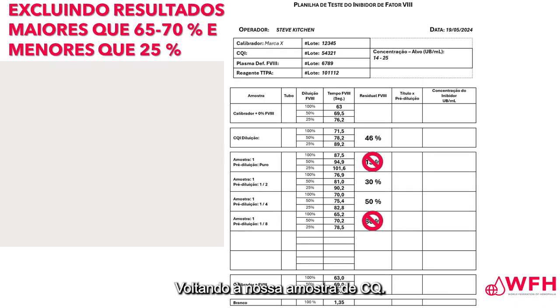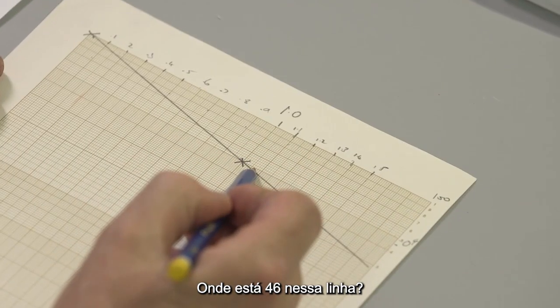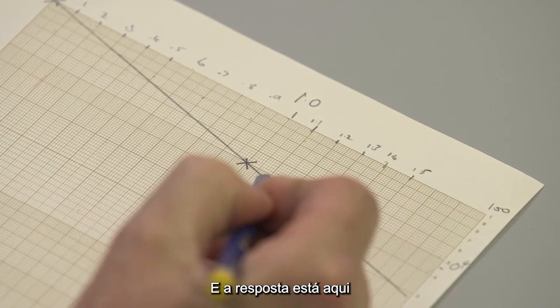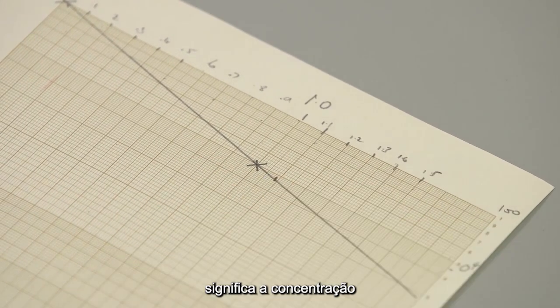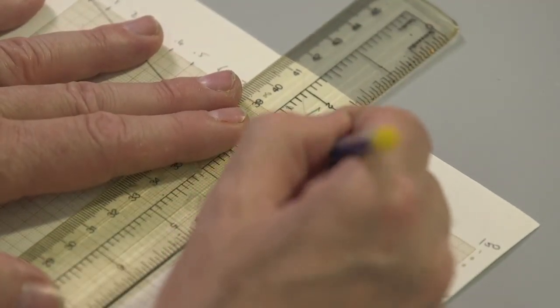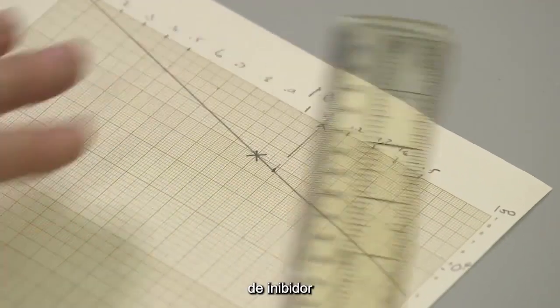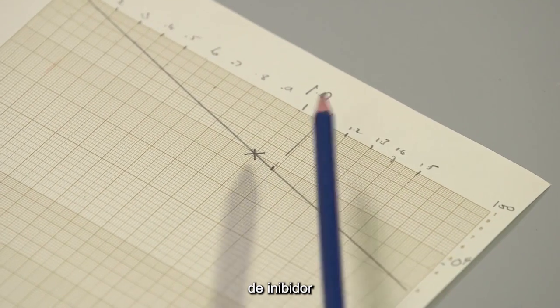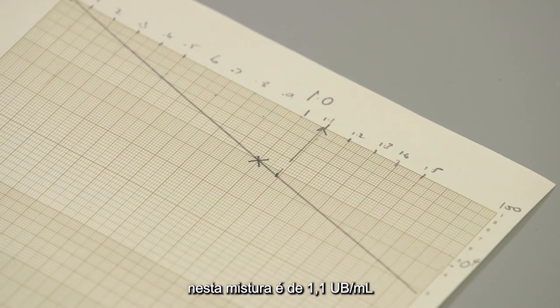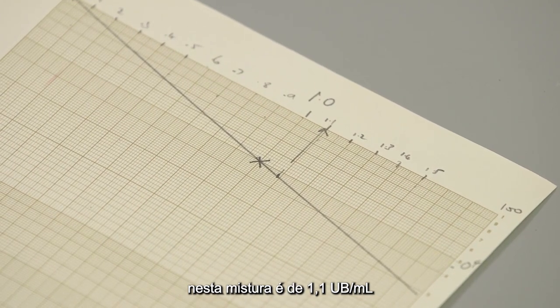Turning to our QC sample. The residual factor VIII, 46%. Where is 46 on this line? And the answer is here. It means the concentration of inhibitor in this mix is 1.1 Bethesda units per mil.